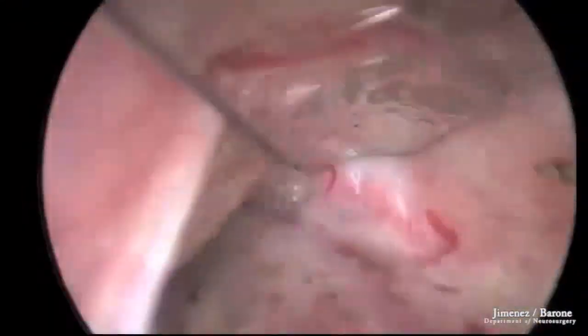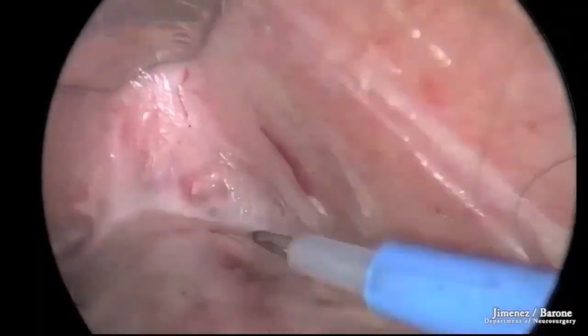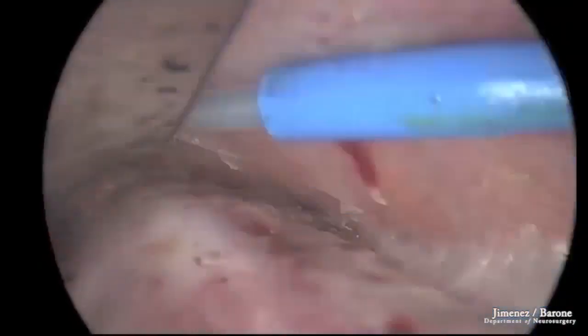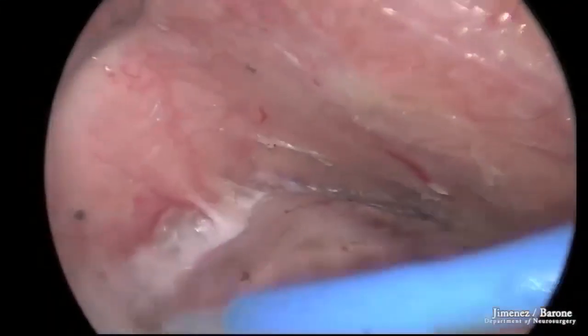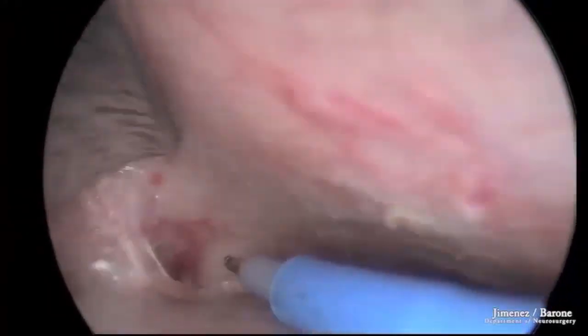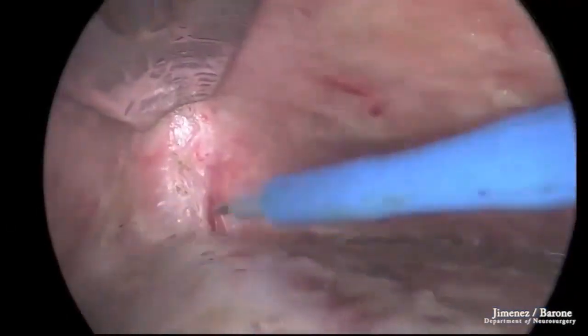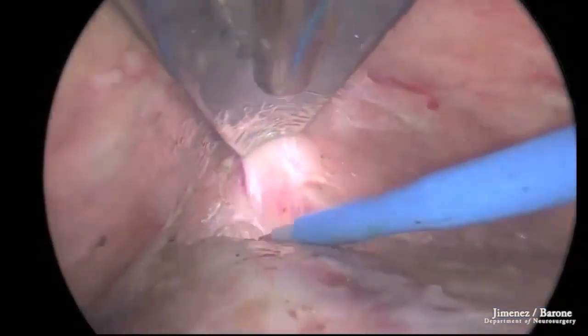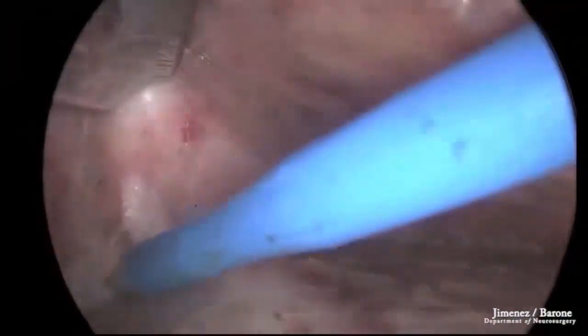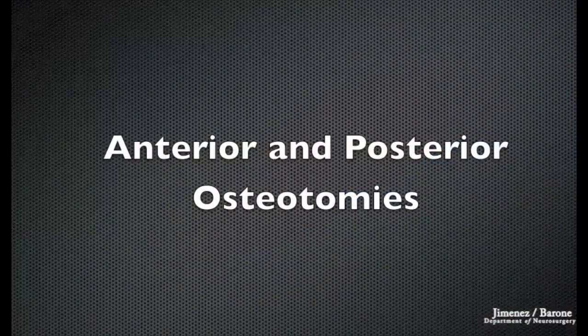Subgaleal dissection is made with monopolar in a plane below the galea and above the pericranium. This is done in a totally bloodless fashion, taking care to cauterize any bridging veins. Dissection is carried out from the anterior incision towards the posterior incision, thereby exposing the entire subgaleal plane between those two. Retractor is used to elevate the scalp.